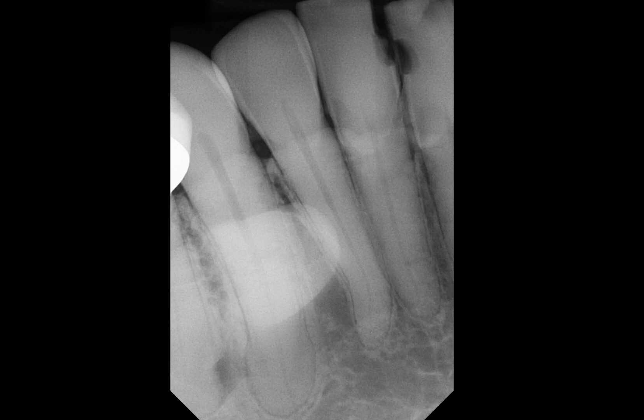Hey guys, how are you? This is Dr. Kim. I want you to look at this periapical radiograph. Let's pay close attention to tooth number 27.